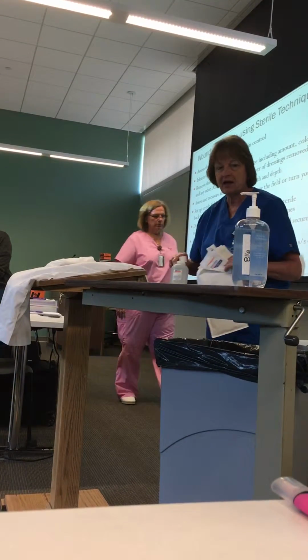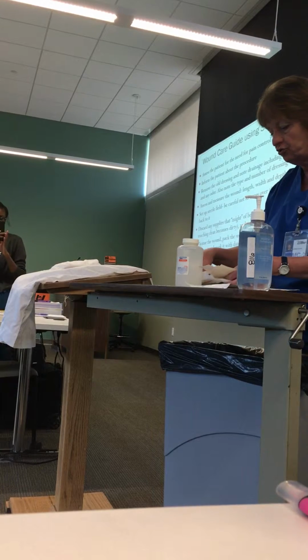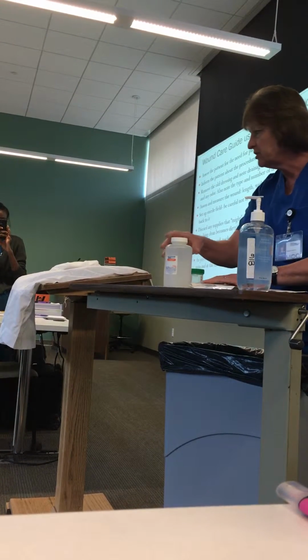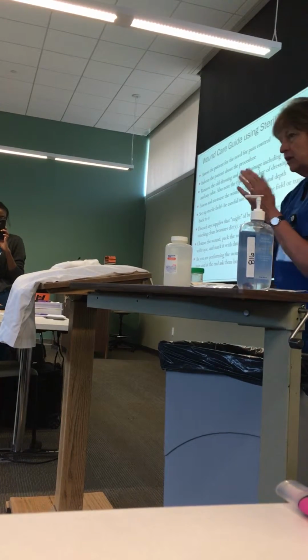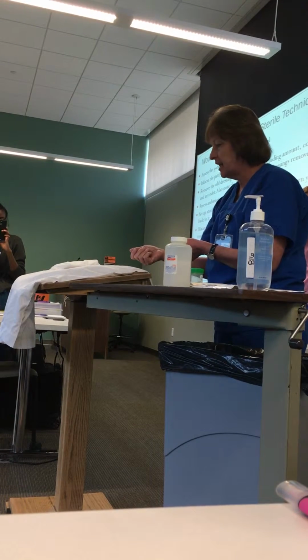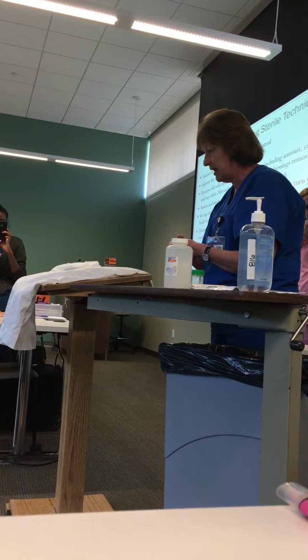So I've got all my supplies. Knock, knock. Hi, Mrs. Bellman. I'm Kathy. I'm your student nurse. I've got a dressing change to do this morning. What I'm going to do is provide for privacy and wash my hands. You'll have an order, so I'll positively ID her using our identifiers: her name, date of birth, and does she have any allergies.